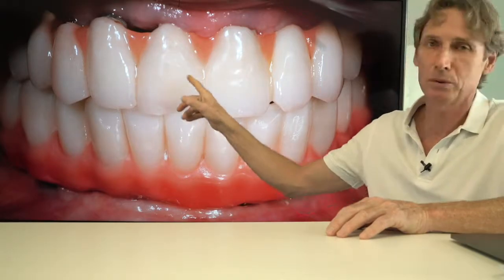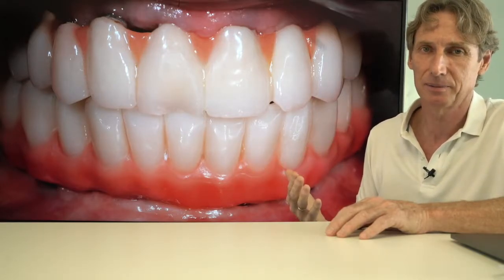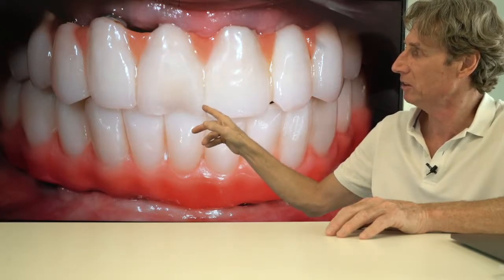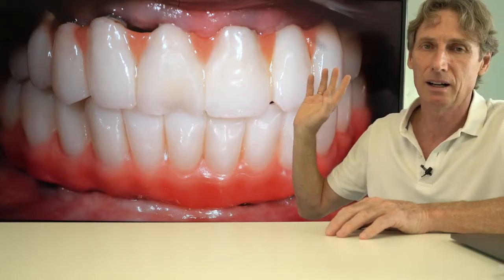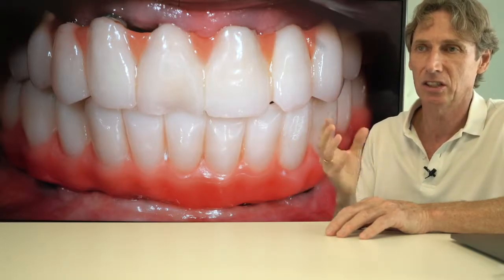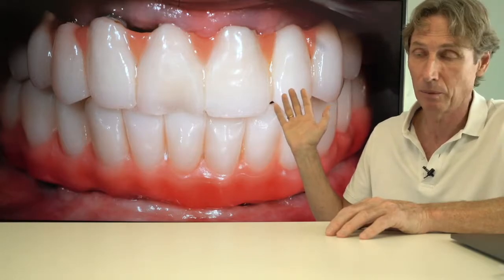This fracture was produced about 8 years ago, and we were not really able to repair it with composites. So the patient decided to leave it like that, because if we make a repair here, getting away the ceramics, gluing a ceramic veneer in there, we have seen in other cases we might change the structure of the whole bridge and damage it even more.